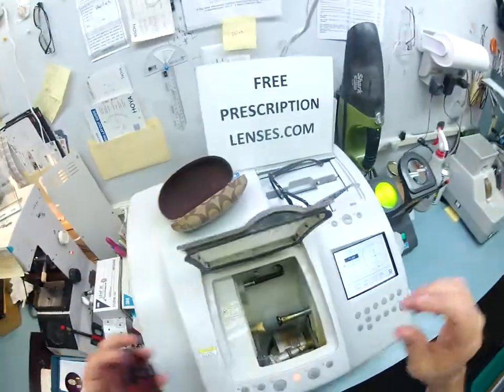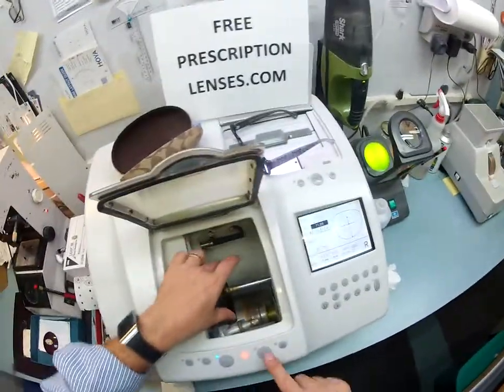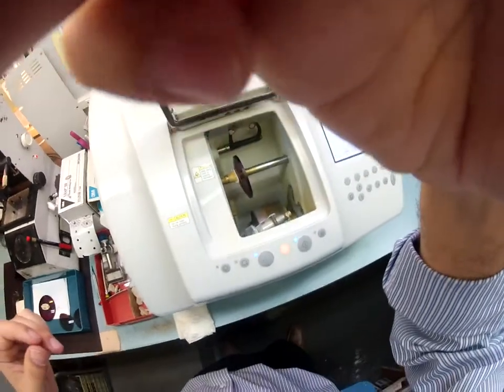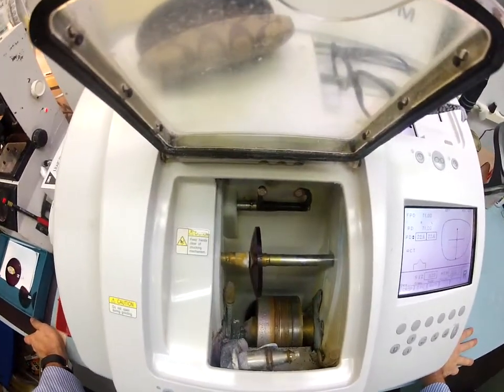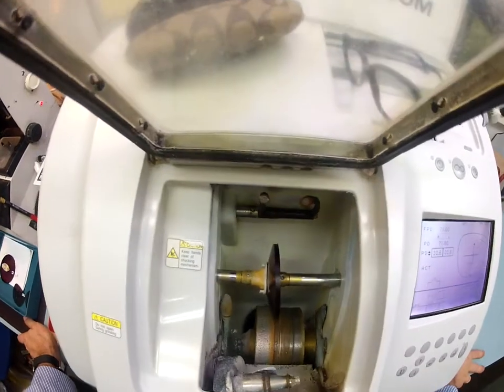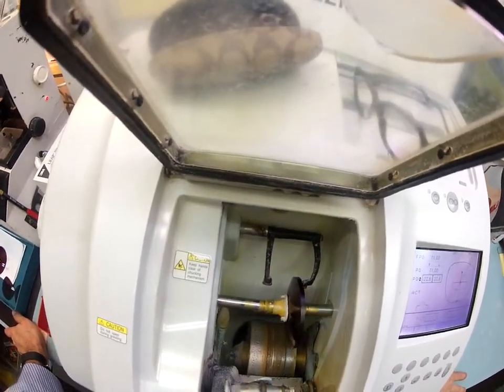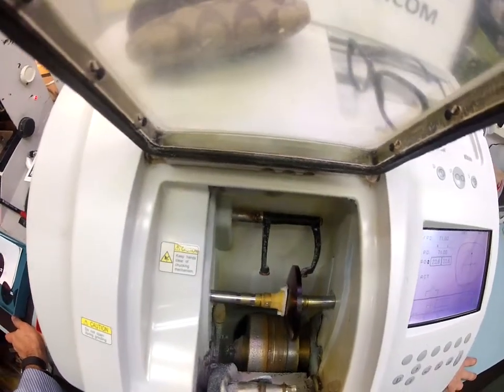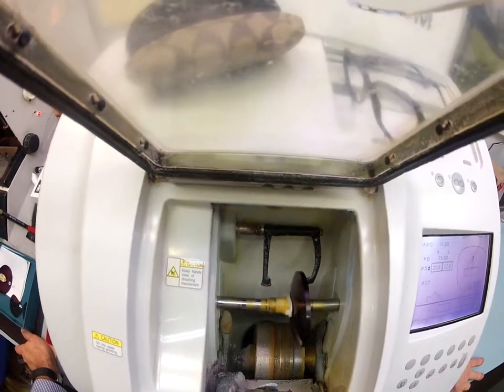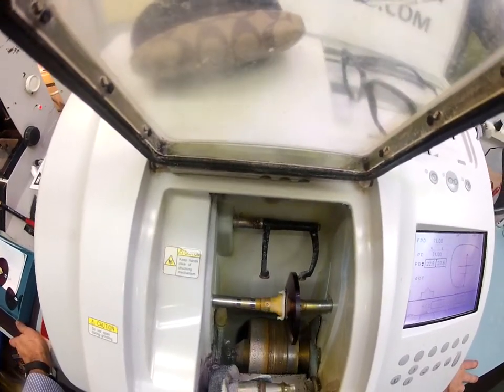Let's grab the right lens, put it into the chuck. Hello, Chuck. And then hit start. So I'll reposition the camera where it's a little more comfortable. The first thing that's going to happen is these calipers are going to come down and trace the shape of your frame onto the lens to make sure it's large enough. It's going all the way around now. It's tracing the concave side of the lens first. Then it's going to scoot over and trace the convex side. The concave side is closest to your eyelashes.